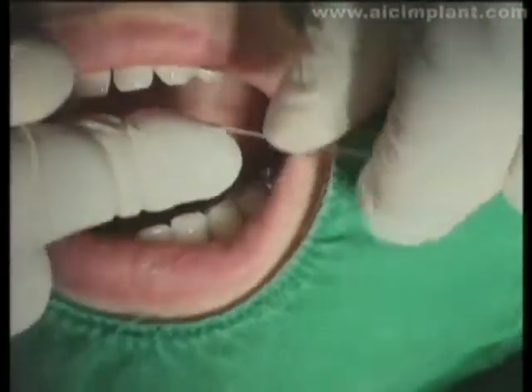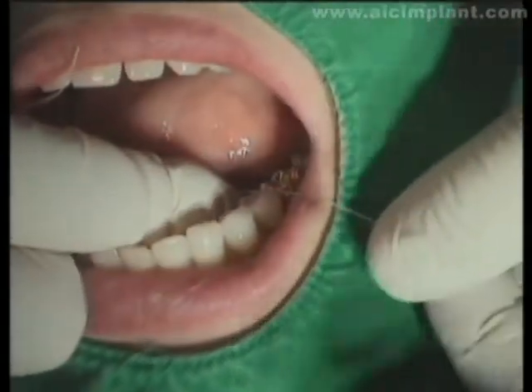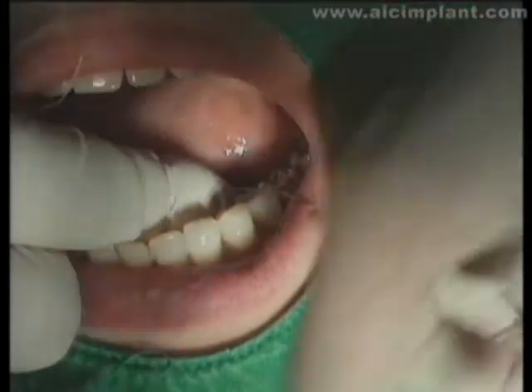The intensity of the contact points and margin fitness must be verified before proceeding with the occlusal adjustments.